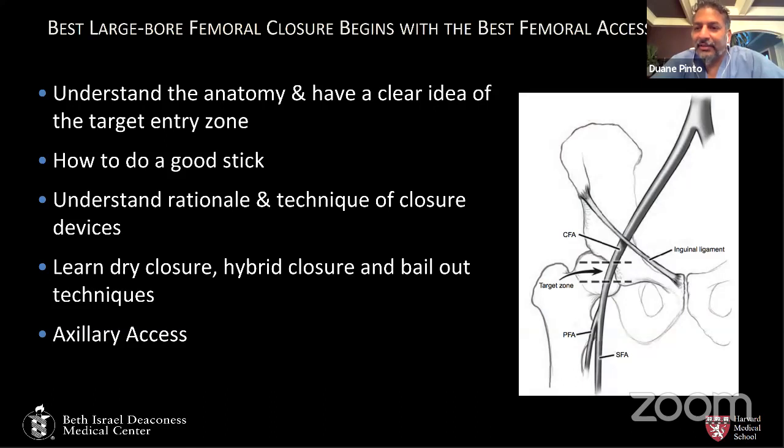shouldn't actually be dilating it or accessing it. So let's start with what are we going to call the different parts of the artery. And I've outlined for you here the inguinal ligament, which defines when the external iliac is going to start moving posteriorly and into the retroperitoneum. So you always want to be below the inguinal ligament. And we'll talk about how to define that anatomically.